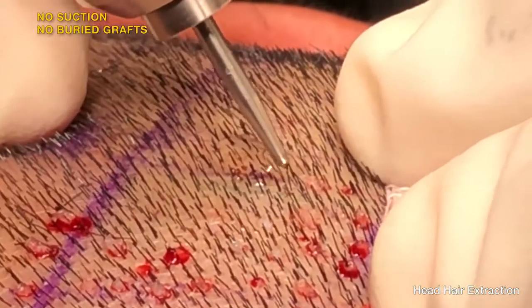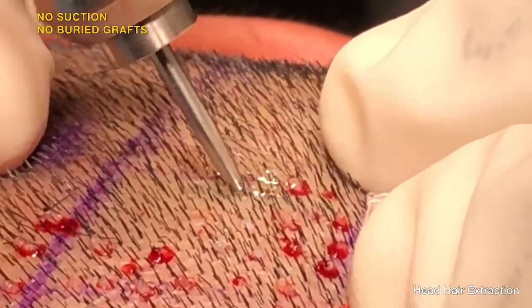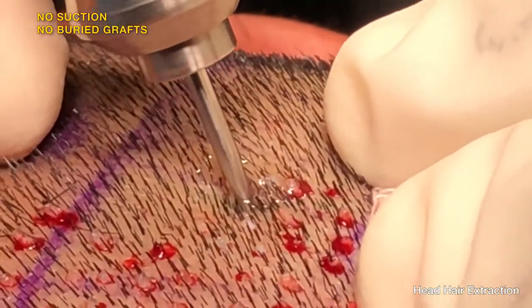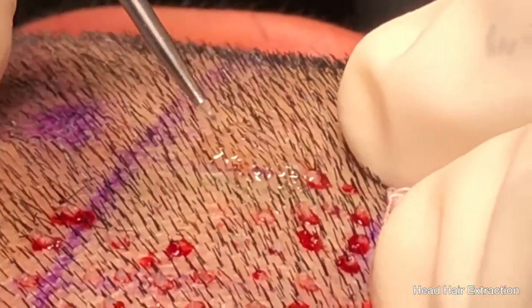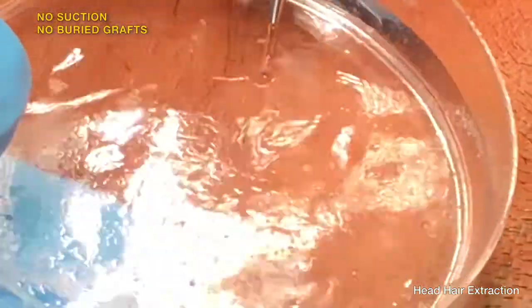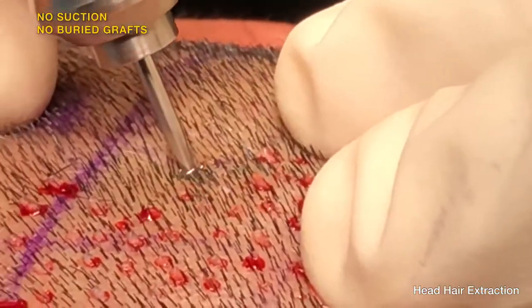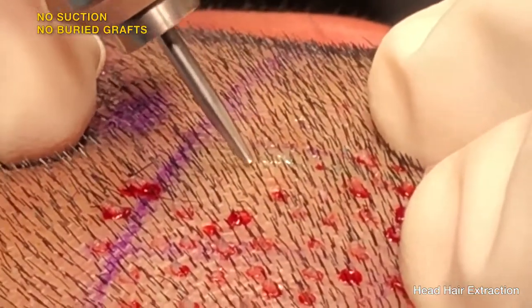The fluid drip keeps the graft alive. It also lubricates the punch, and when the punch comes out and it's time to collect the grafts, there is no need to struggle or spend time manually getting them out. Just pressing the pedal activates the hands-free fluid system that ejects all the grafts while keeping the grafts well hydrated for better survival.